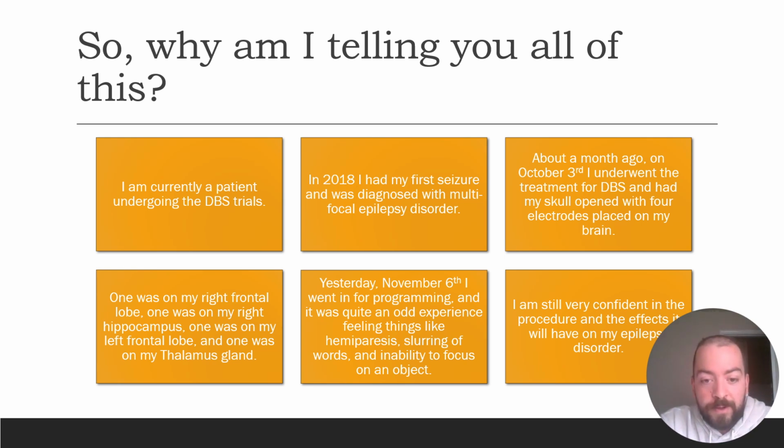Yesterday, November 6th, I underwent programming. It was quite an odd experience, honestly. Feeling things like hemiparesis. Basically, they would turn up my left frontal lobe, and at one point my right finger felt numb, and I told them about that, and they said that's normal, we'll keep going. And then they turned it up one more, and my nose to my right eye felt numb right in here. Told them about that, kept going. And then on the next one, my whole right side of my body got numb and I couldn't feel anything. They said that's basically my tipping point.